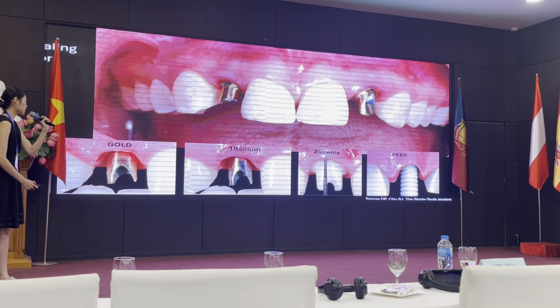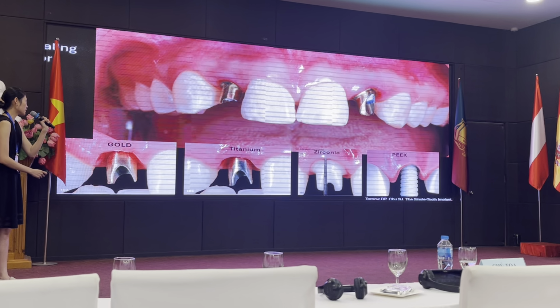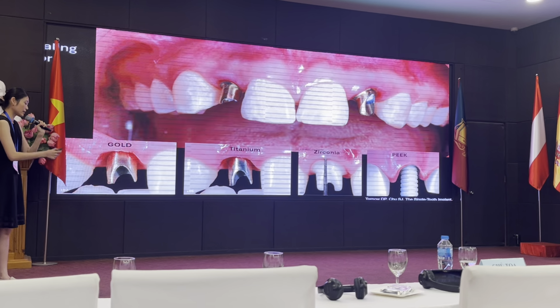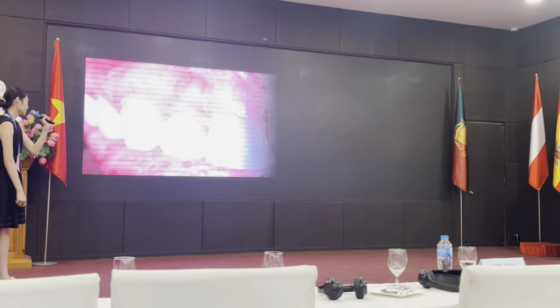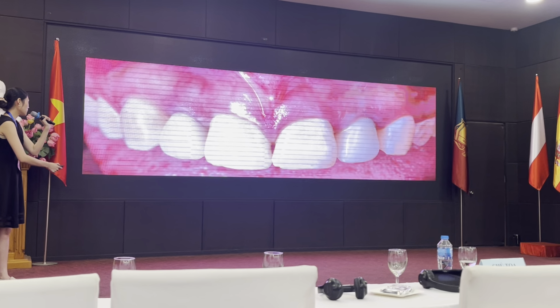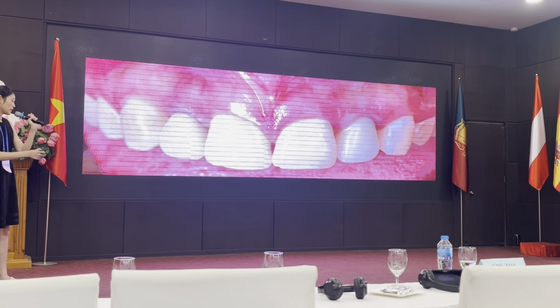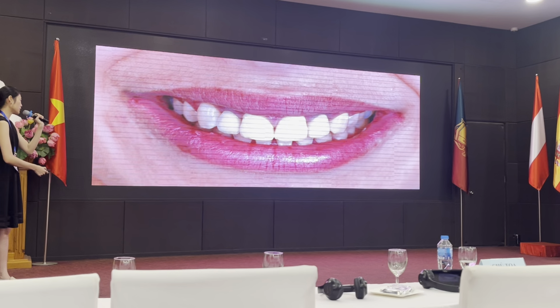And this is how it looks. And I wouldn't say this is perfect because you can still kind of see the tissue defect here, but the patient is really happy with that. And this was the final result. And another thing to be careful of is patient's oral hygiene, because you want to make sure the patient can keep really good oral hygiene. That would be the long-term success for the patient.